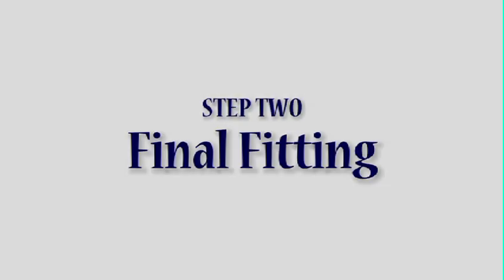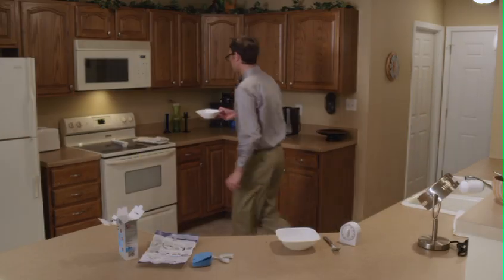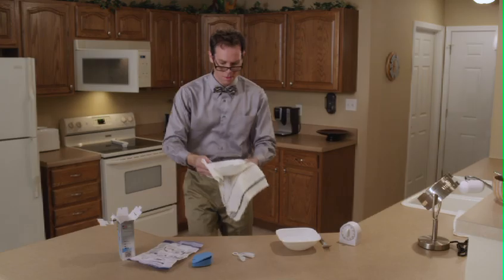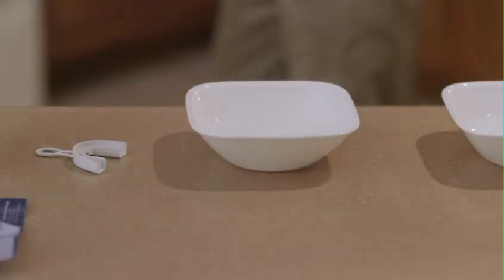Step 2: Final Fitting. Using a microwave or stove, bring a bowl or pot of water to a rolling boil. The water should be at least one and a half inches deep. Remove the boiling water from the heat source and let it rest for 10 seconds. Use caution when removing from heat.